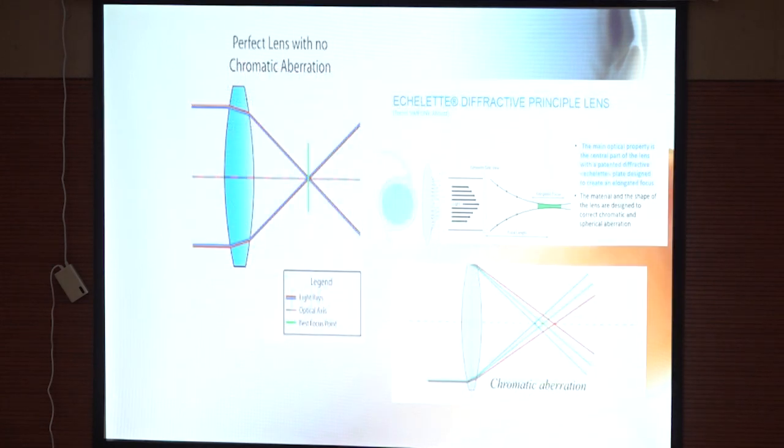Now we have a new IOL design which has the echelette design, which creates an elongated focus. So instead of apodization, it has these gratings, but it creates an elongated focus. Also it decreases the chromatic aberration.